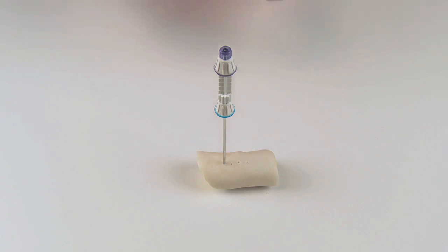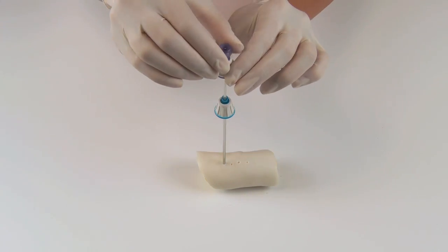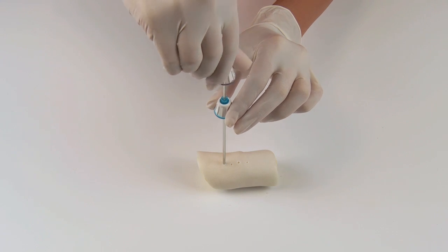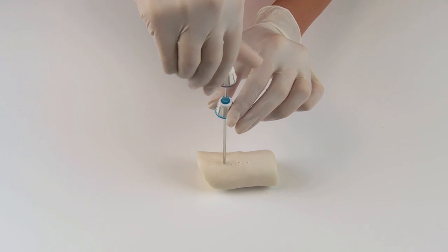Now break off the number of indicators corresponding to the desired length of the sample. Remove the stylet and rotate the biopsy needle clockwise while applying slight downward pressure to the stop.